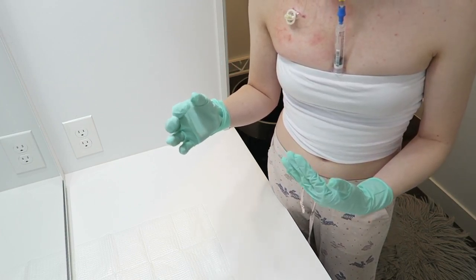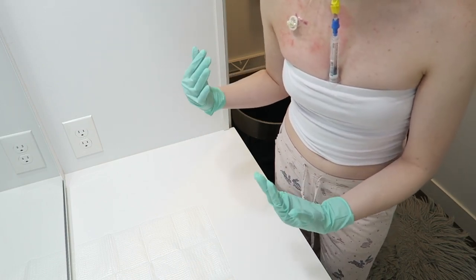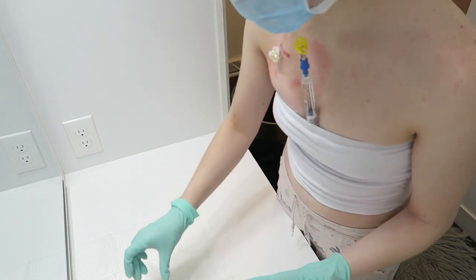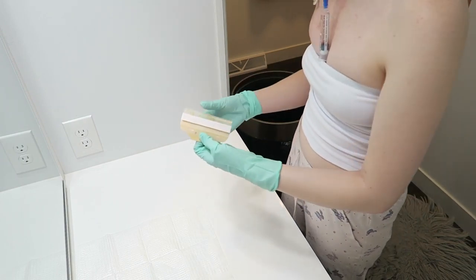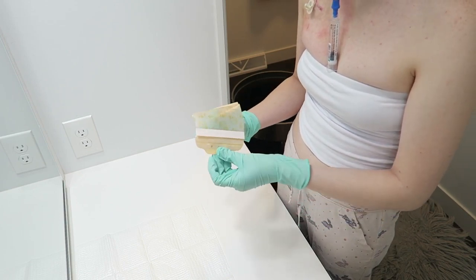So it's still a little bit sticky, so I'm gonna wait. Again, you never fan the area because that's fanning bacteria into the sterile area. Okay, now it seems pretty dry. So we're gonna go ahead and take our, why can I never think of the name? Opsite, I guess you can call it. This is going to go over the area.